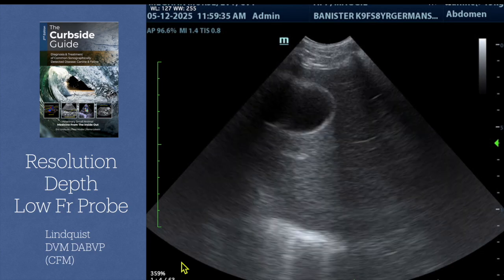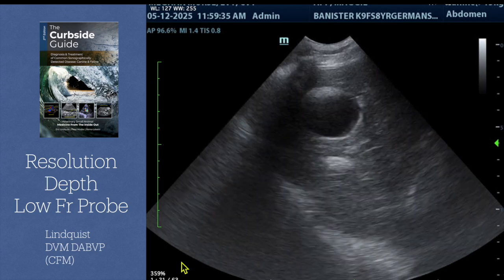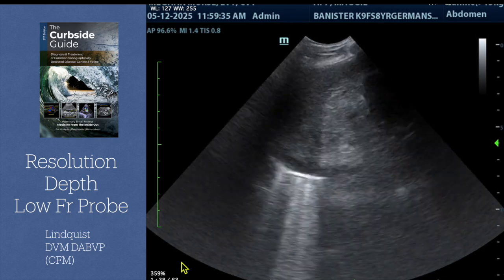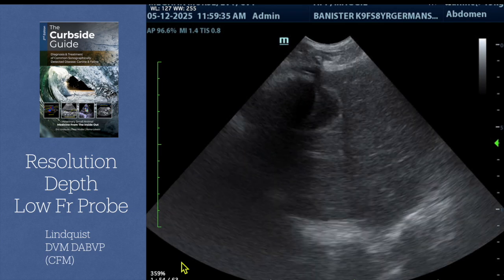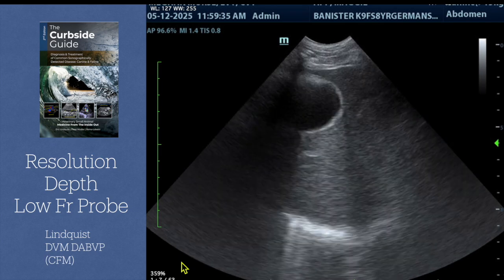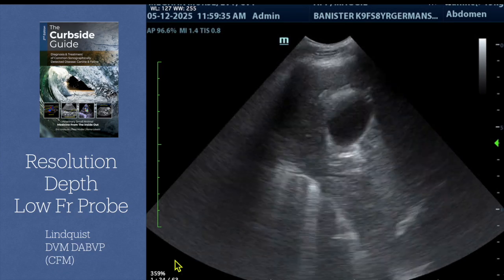And therefore your reports become better and they're not nebulous and nothing says, oh, you didn't find the right adrenal gland and I don't see it. You know, it doesn't look good on you. So check your resolution depth first and then decide what you need to do from there. Okay, hopefully this helps. And if you need us for anything, we're at sonopath.com.